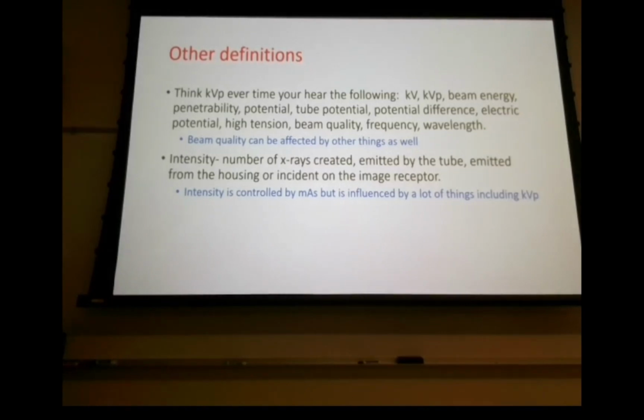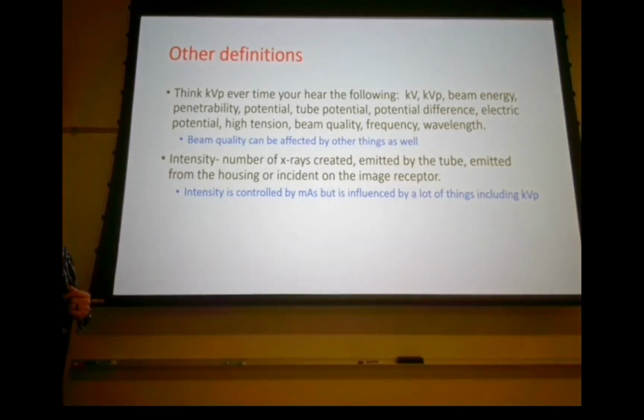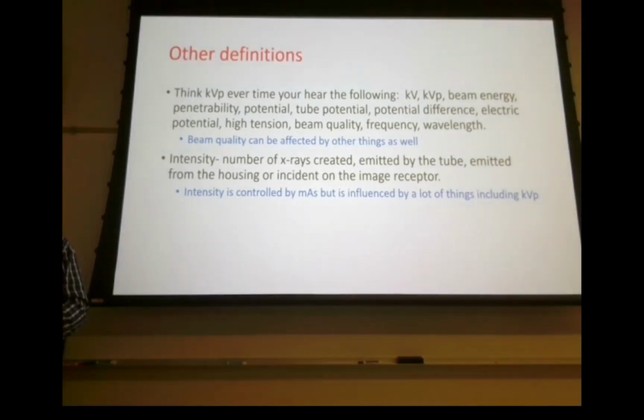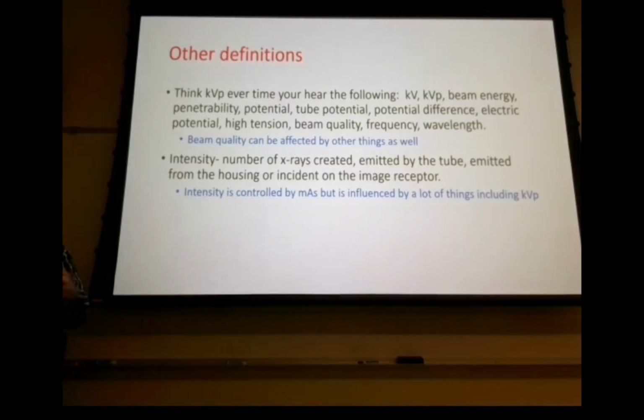So you can set as low a kVp. I really encourage y'all to do this. I know I sound like a broken record. Not that you know what a broken record is. It skips, all right? It skips and it goes back and it says the same thing over and over again. That's why people say, yeah, sound like a broken record. I sound like a broken record because I say play with your equipment, right? Play with your equipment. Mock up a patient.